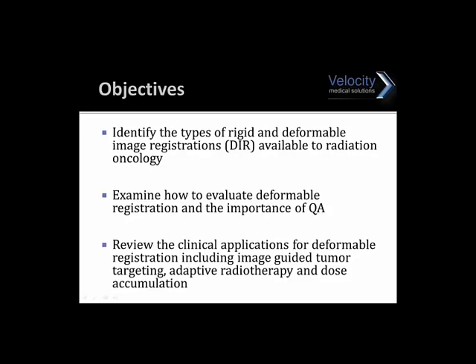Through this presentation, we're hoping to identify the different types of rigid and deformable image registrations, how to assess those deformable registrations using QA, and then how to review some of those applications of deformable using real clinical cases.